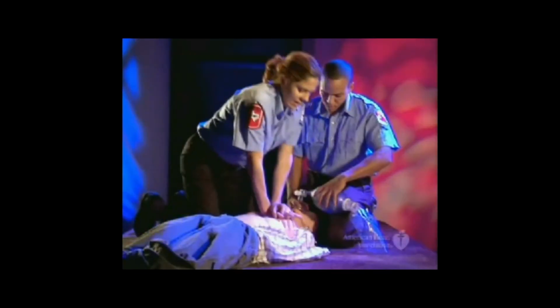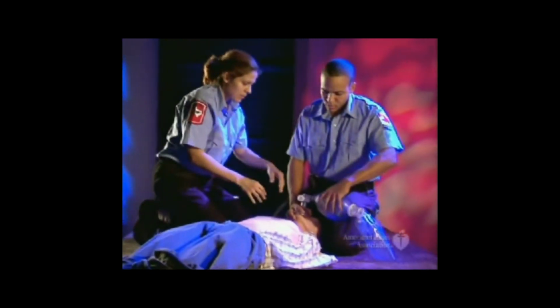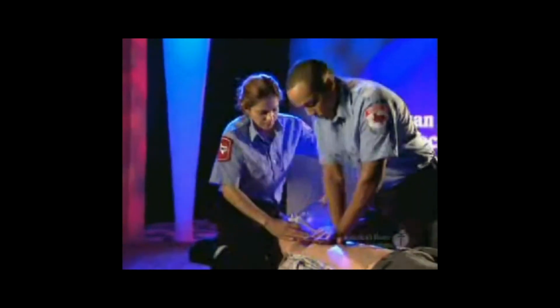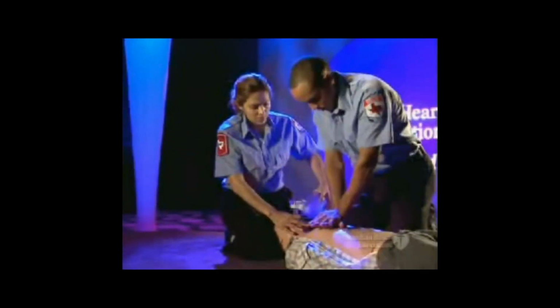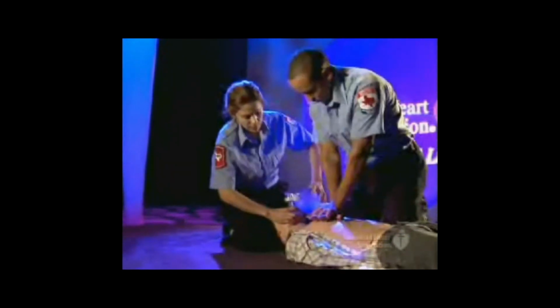This will help reduce the chance of gastric inflation, air going into the victim's stomach instead of his or her lungs. If too much air enters the stomach, it can cause vomiting and potentially aspiration. If you're performing 2 Rescuer CPR, you can use the EC clamp technique to hold a mask in place. This technique requires instruction and practice. Here's your chance to do it.